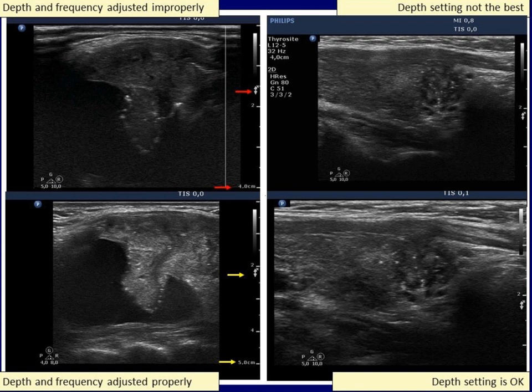So far in the presentation, I have dealt with the problem of large nodules. At the same time, if the settings are optimized for an average thyroid size, it may be necessary to change them in individual cases, even for a smaller thyroid gland. This was the case with the right nodule — decreasing the depth resulted in an enlarged view of the nodule.